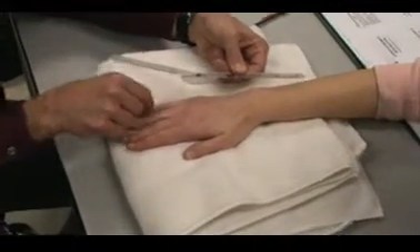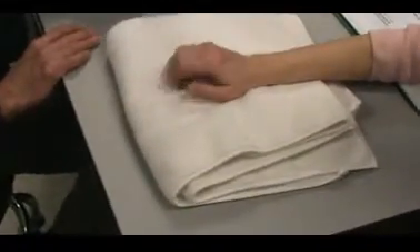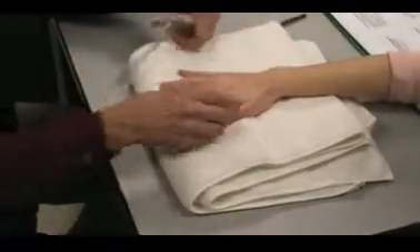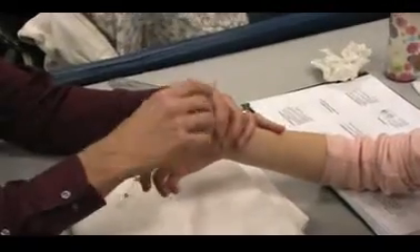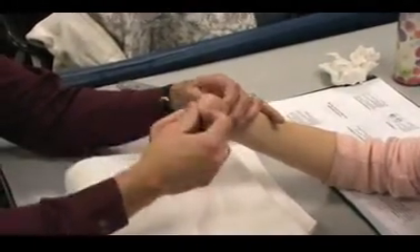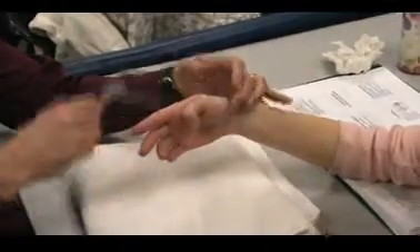We want to make sure she's got 0, and she does. She can come back to the neutral position. So if we're doing MCP, let's do thumb MCP. We do some gross range of motion just to make sure she's got some thumb motion. So then I'd have her bend her thumb MCP.